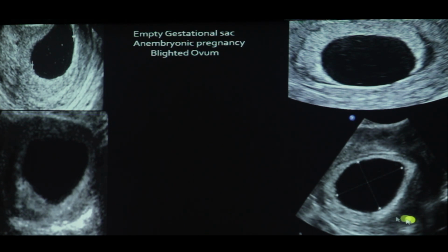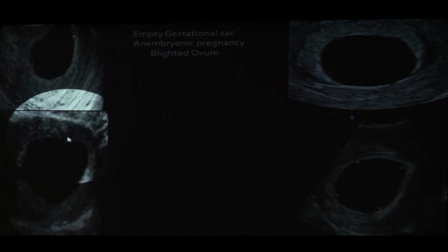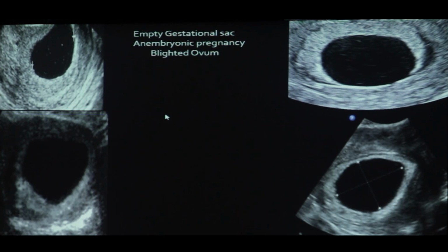Now see here, I am not making out the decidual reaction even from the top. Why am I saying top? Because here the beam strikes at 90 degrees, and if I am missing it from the top, I will not expect it to come from the side, because even the best angle is not showing me any decidual reaction.